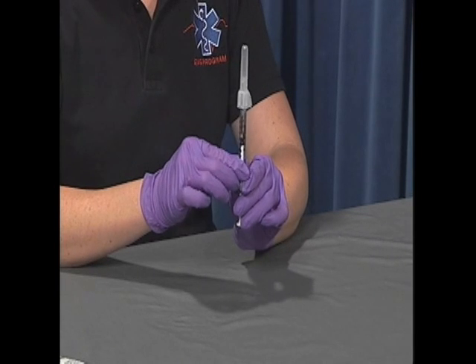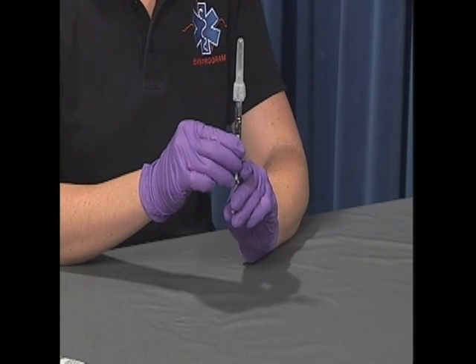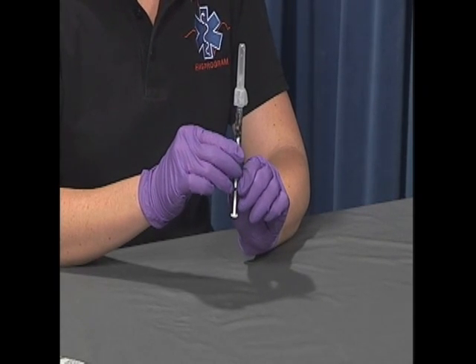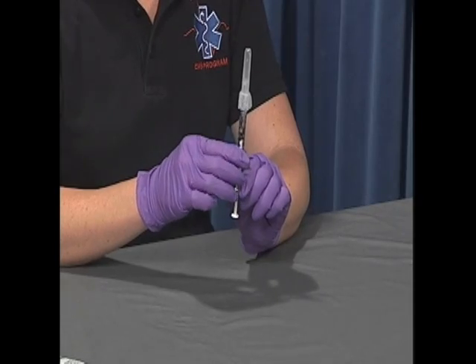With the needle pointing upward, gently tap the syringe to move any air bubbles to the top of the syringe. Then gently depress the plunger of the syringe until air is expelled and only the desired amount of medication remains in the syringe. The medication is now ready for administration.